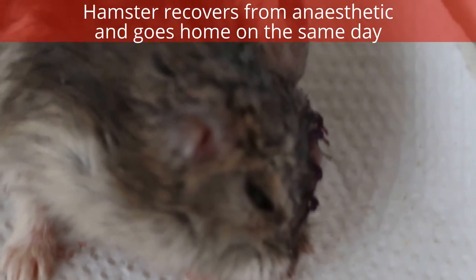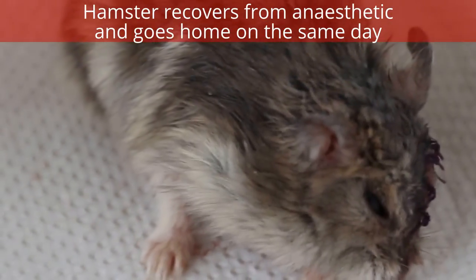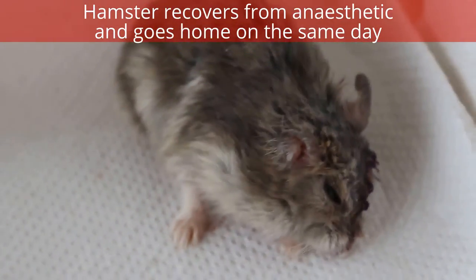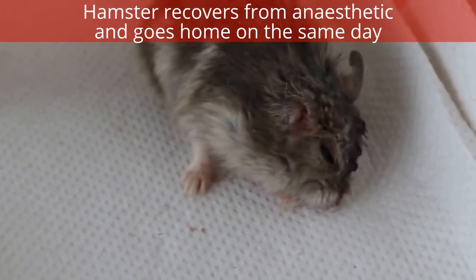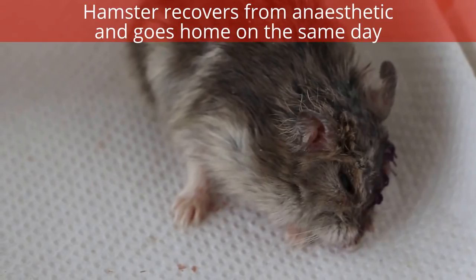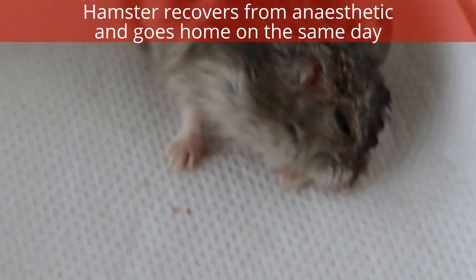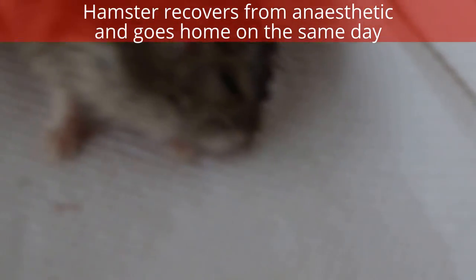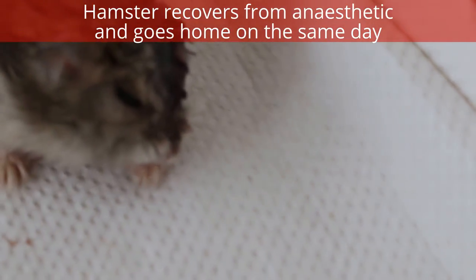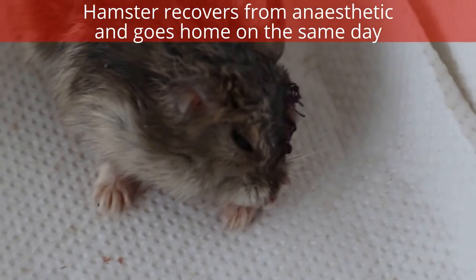It's a joy to see a hamster alive after anesthesia, which is the main thing. In this, success or failure, the outcome is actually the anesthetic. And of course the speed of surgery. If you take too long, topping up with gas, you just kill the hamster because they can't withstand long surgery. Hello? It's okay. It looks a bit dazed. I'll get some food and water for him.